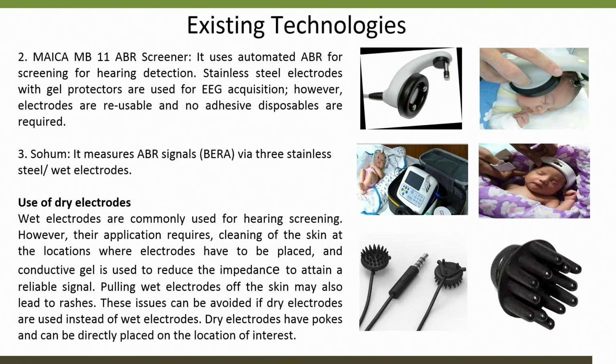Now, wet electrodes are commonly used for hearing screening. However, their application requires cleaning of the skin, first thing, at the location where the electrodes have to be placed, and second, it requires conductive gel to reduce the impedance. Why? So that we attain a reliable signal.